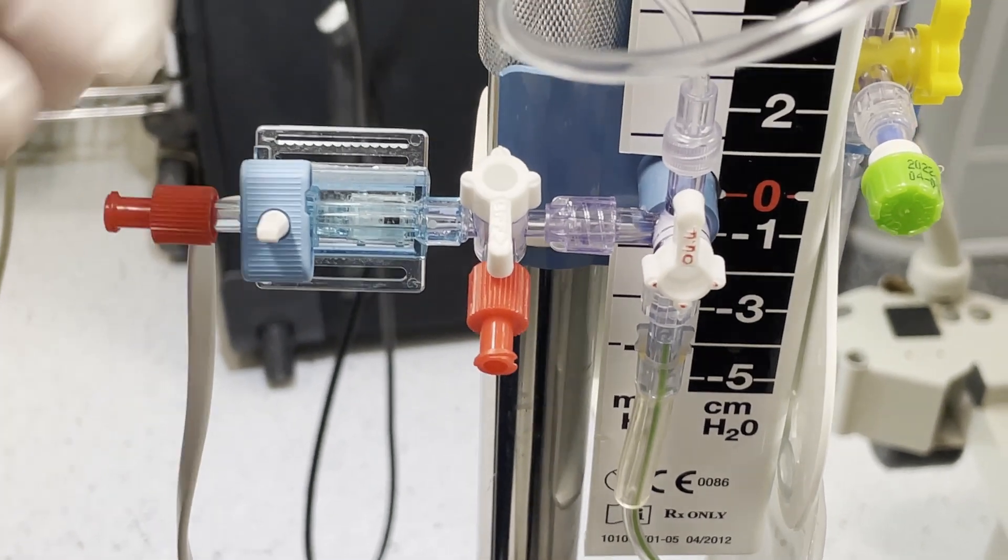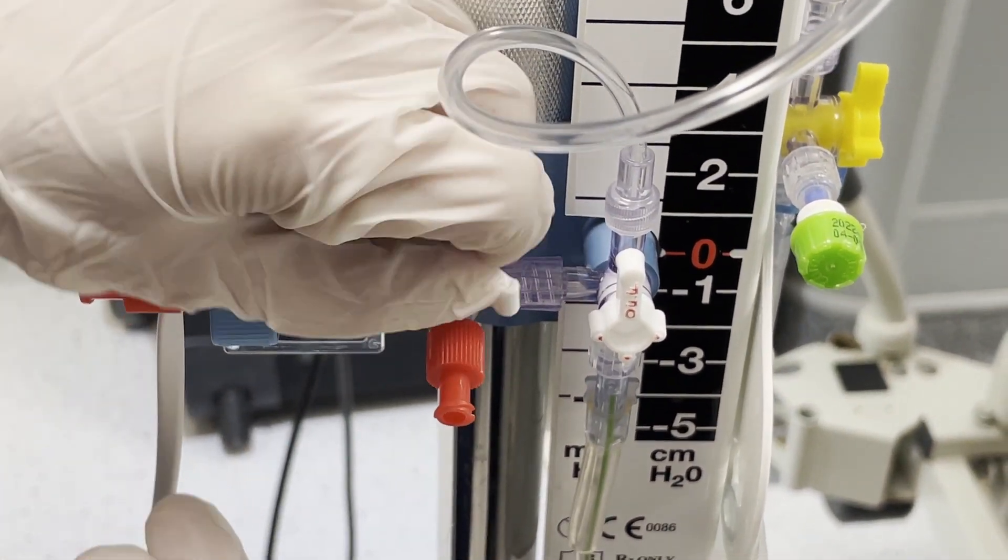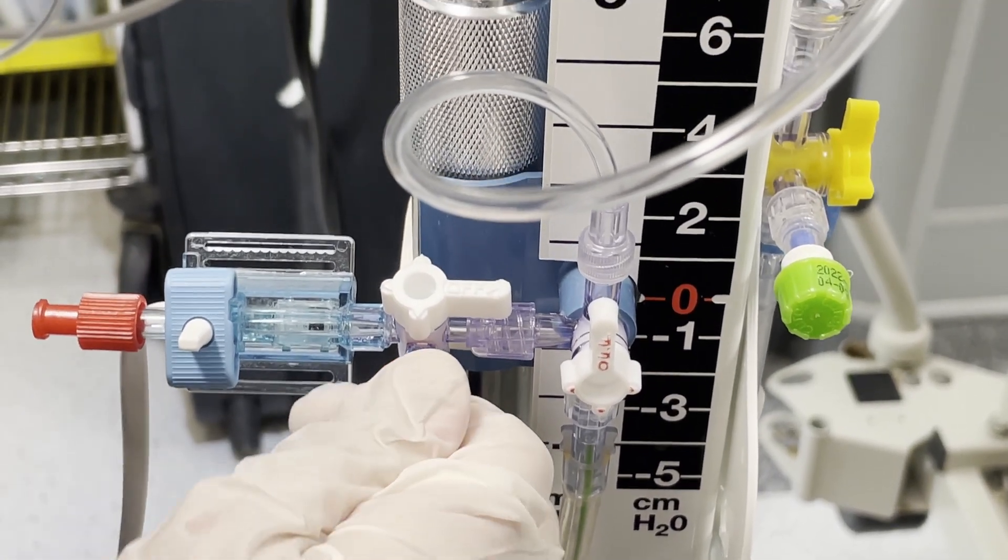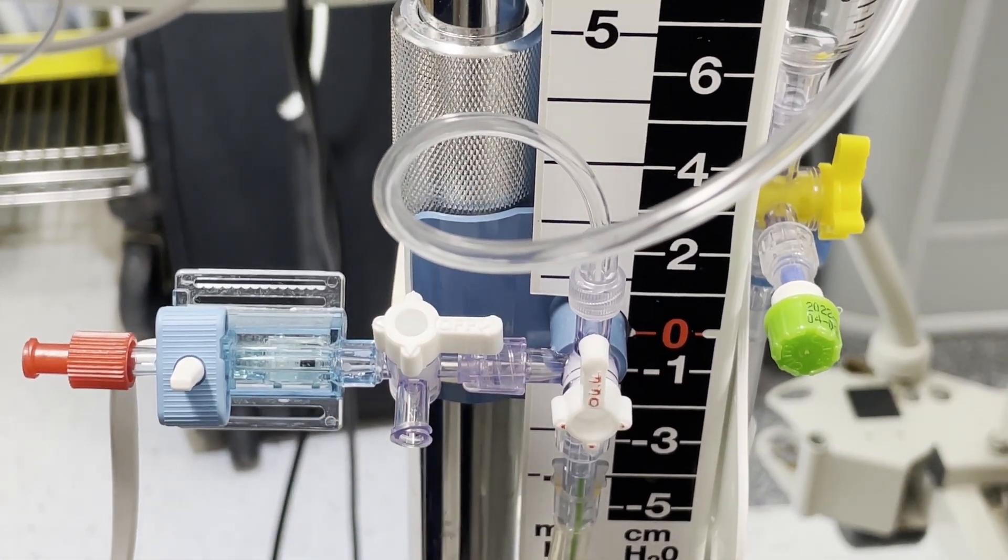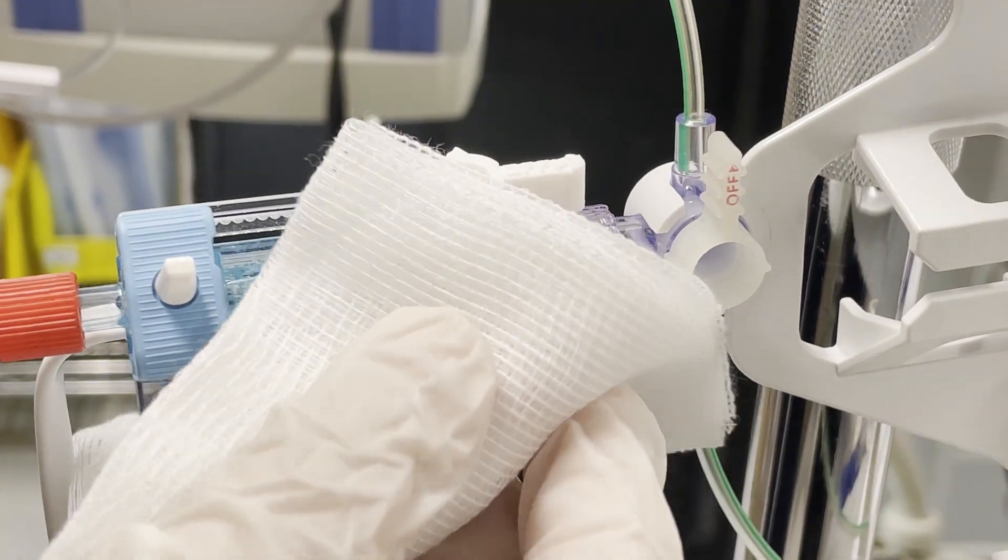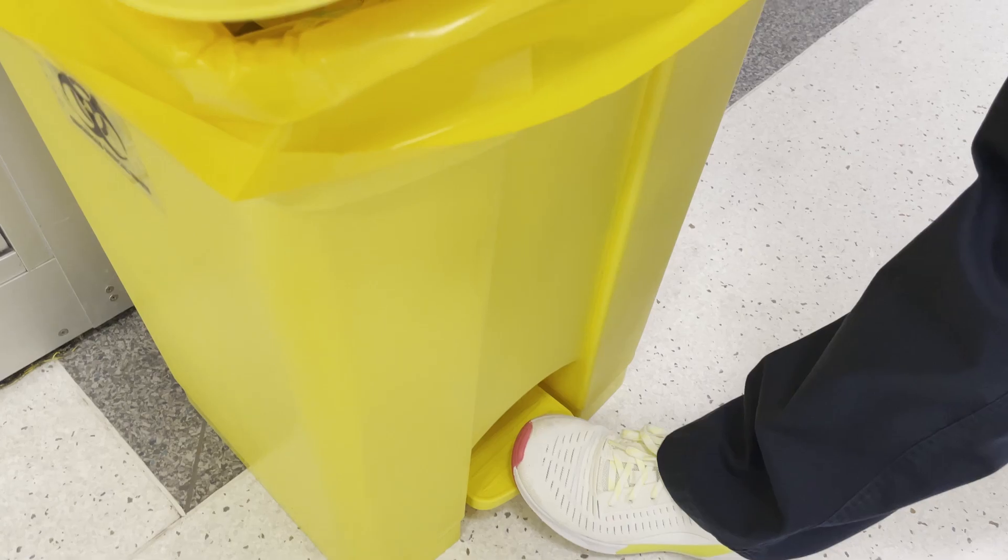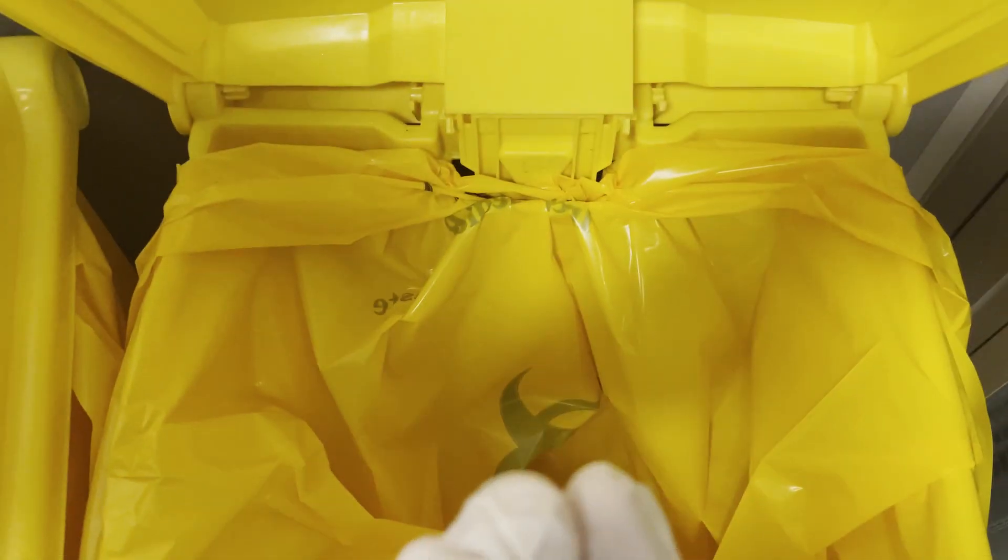Remove the non-vent cap using non-touch technique, or in some institutions they will use sterile gloves. The main idea is not to touch the system and to discard the non-vent cap.